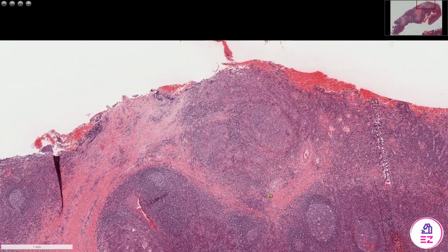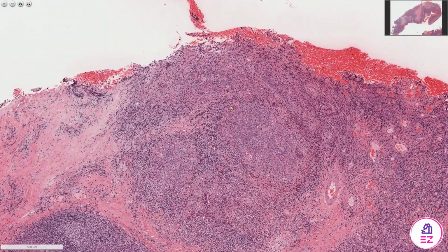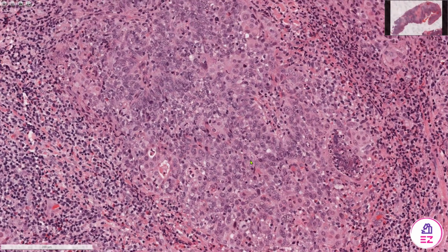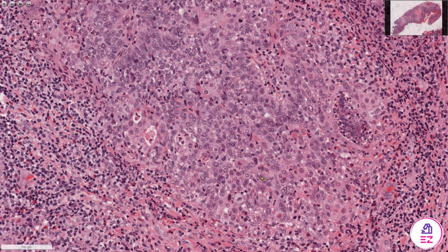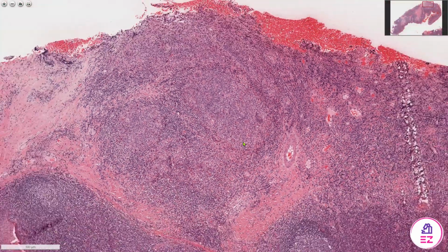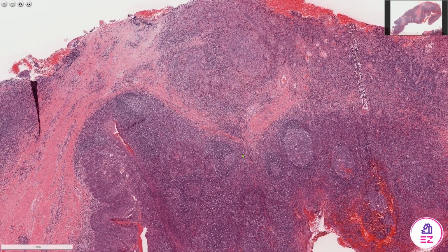In actual fact, this tumour is quite insidious because it's growing within the lymphoid tissue and is quite hard to discern, but there's further carcinoma here, which is best demonstrated by the fact that there are lots of mitoses and atypical cells within it, and these pale areas of carcinoma are not to be confused with these lymphoid follicles.